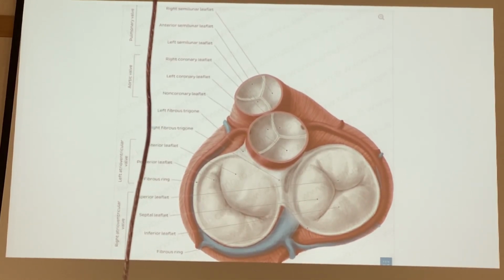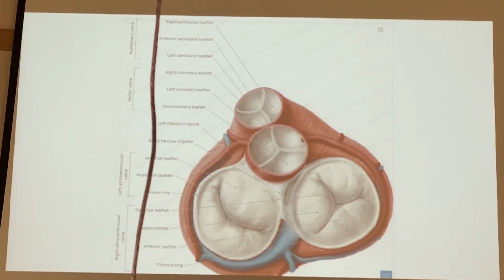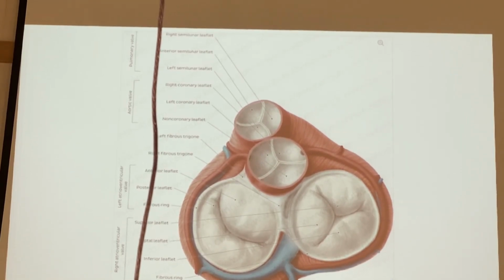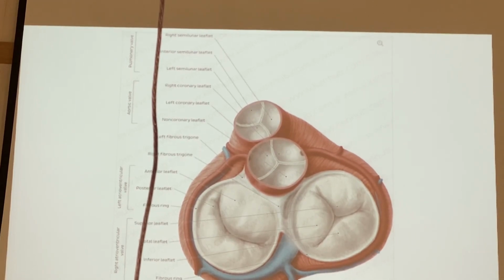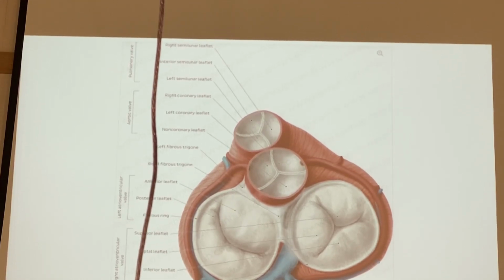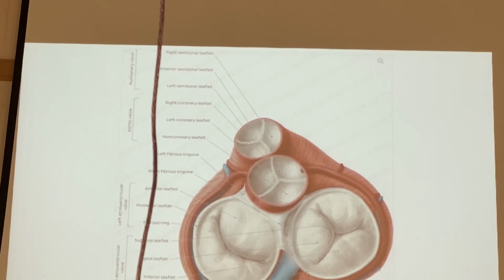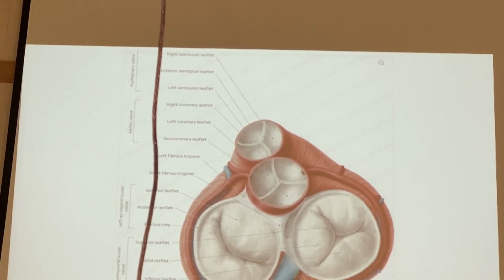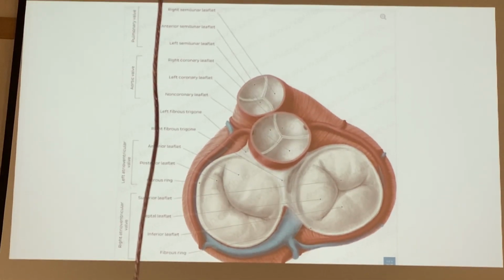The second part is that triangular area, which is the trigona fibrosa, which is connecting all these annuli fibrosi. Trigona, triangle, trigona fibrosa. So now we have two parts of three structures forming the cardiac skeleton into which the cardiac muscles are attached. Annuli fibrosi, trigona fibrosa.